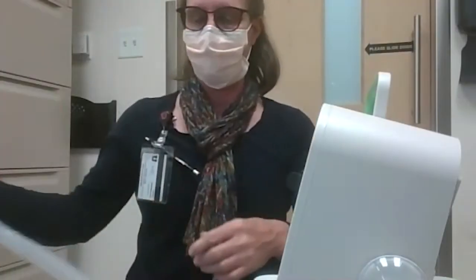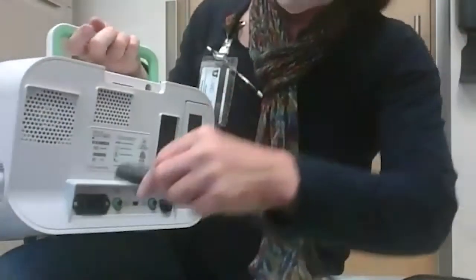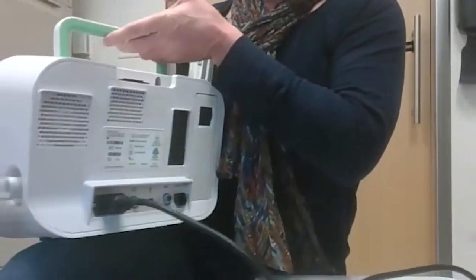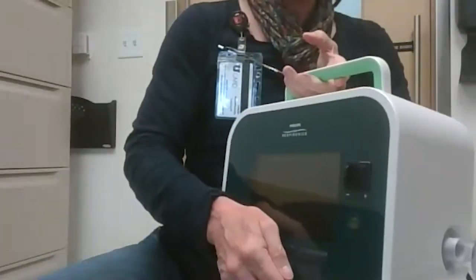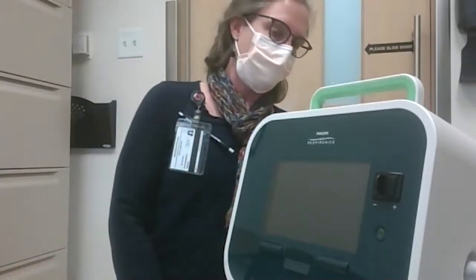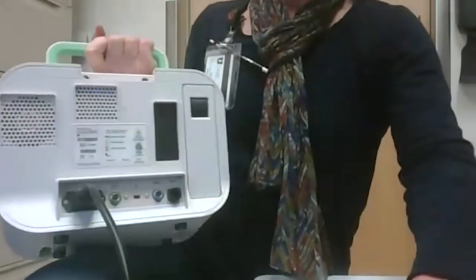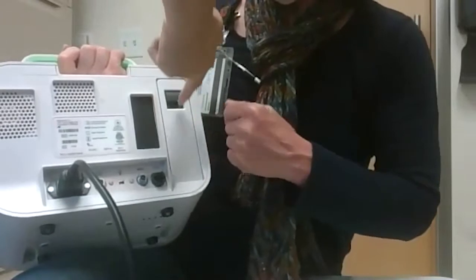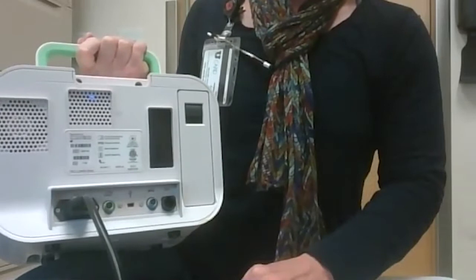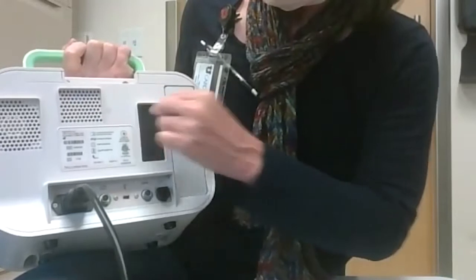To use the cough assist machine, you will want to make sure that the device is plugged in both in the back and then to the wall. There are internal batteries on this device, and if it is charged up you can use the internal battery. Also make sure your filter is clear — if you see any dust, just try to remove the dust and that should be fine.